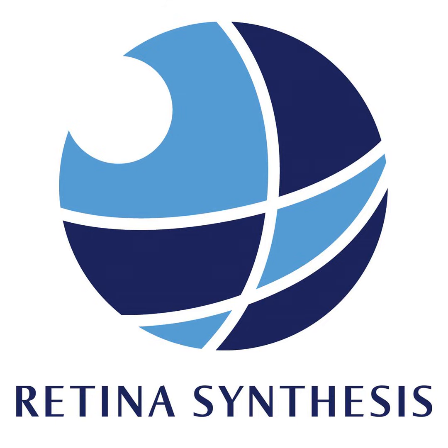In terms of the number of degrees of visibility, what degrees are we at? With OCTA specifically, I think we're at anywhere from 30 to 40 degrees with just your 8 millimeter scans, to upwards of around 100 degrees with your 12 to 15 millimeter scans. And if you montage those, you're probably out in the 125, 140 degree range with some of the montages. So in terms of OCTA, you can get that far out reliably.